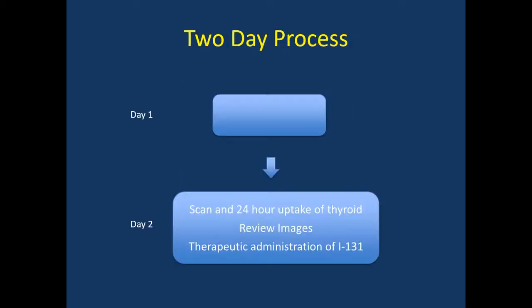Your iodine-131 treatment dose is then ordered by a nuclear medicine technologist. It takes about an hour to receive the dose from the pharmacy. During that time, an IU physician will discuss the scan and treatment with you, in addition to answering any questions you may have. This radiation can affect people around you, so the physician will also discuss with you in detail how you will need to change your behavior around other people. You will also receive paperwork with these instructions to take home with you.